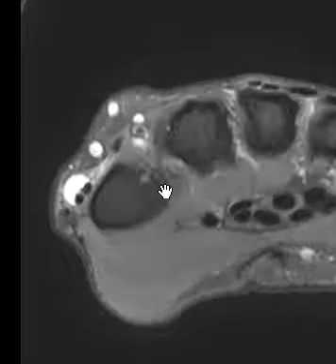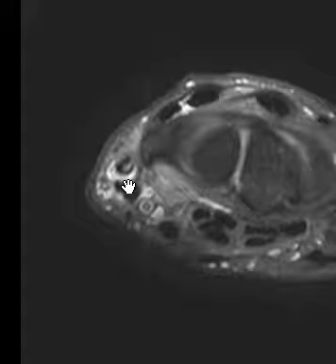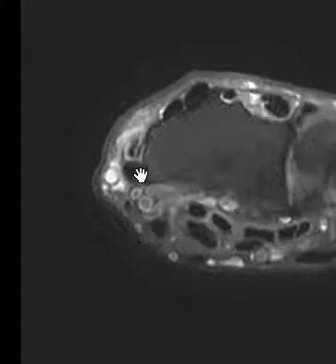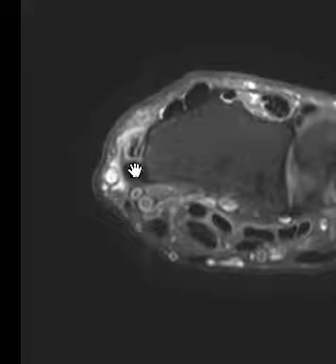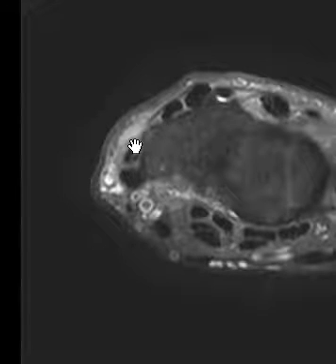So again, Quervain's tenosynovitis with underlying tendon abnormalities, as we can see here, and its friend here next door, the abductor pollicis longus, looks intact. Again, a lot of times both of these will be inflamed or thickened or irregular. Here it looks like it's more localized just to this extensor pollicis brevis.